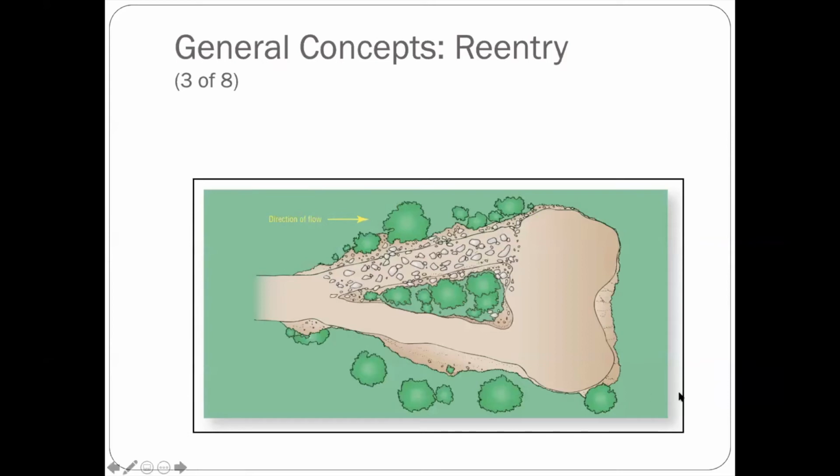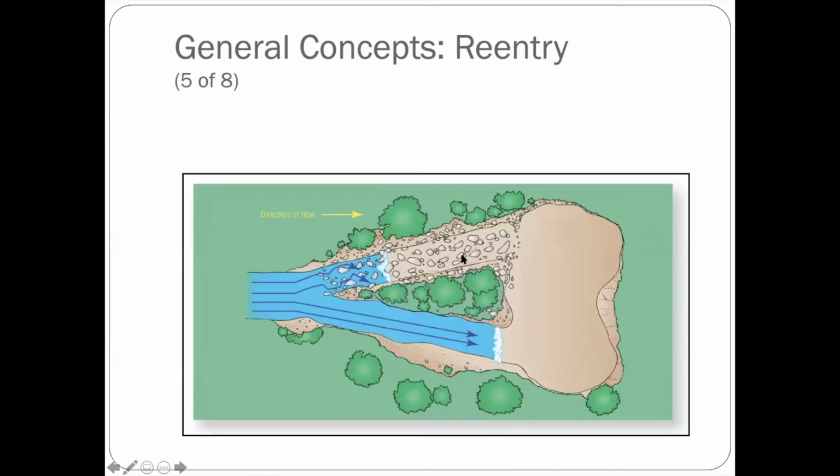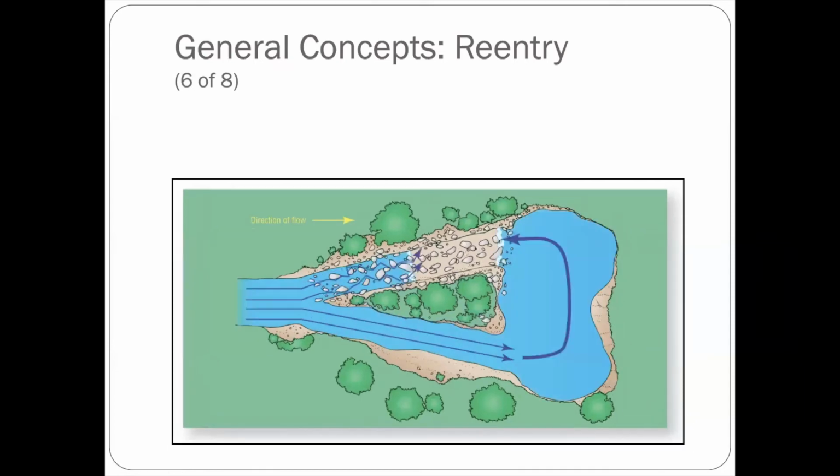So in this cartoon, consider this large area down here, the AV node. The atria is over here to your left, traveling down. The AV node is going to be depolarized by this faster conduction. As the conduction is traveling through this slower area, the AV node would start its depolarization and then pass back up through this area, and then they would cancel out in the middle, and it would not cause any problems. So it looks something like what you see here.